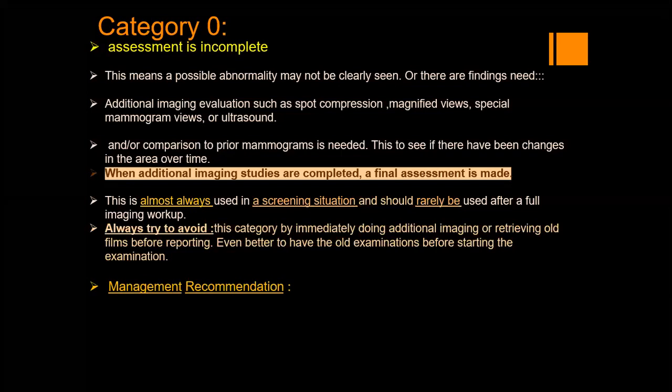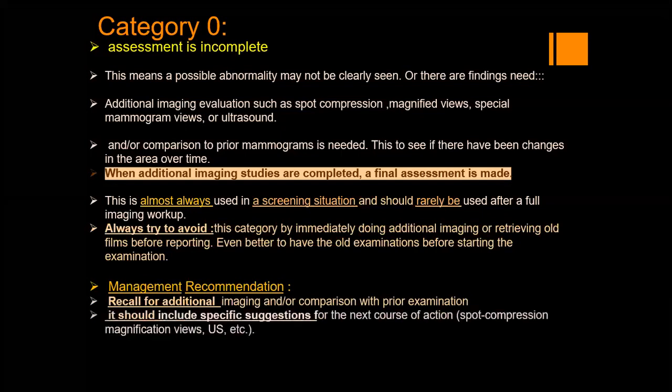So the management recommendation, since we are using it in screening, is recall for additional imaging or comparison with prior. And it should be specified. We should not say just recall or just BIRADS 0. You see, incomplete study. We have to describe why it is BIRADS 0. What is the next step supposed to be? Is it for comparison to prior? Is it for further or additional images, mammographic images, or ultrasound, or all of these?